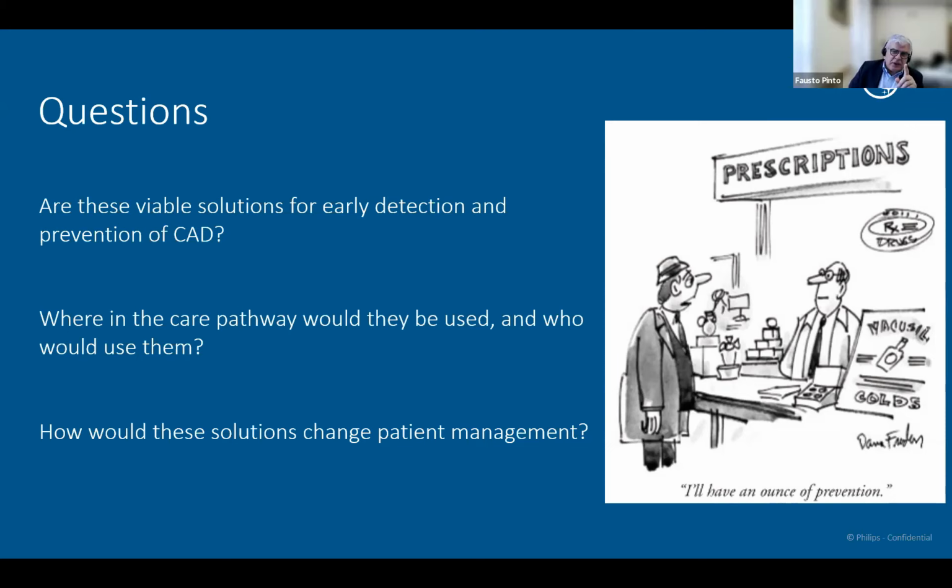No, one additional argument in favor of imaging is that you have an immediate result. With the blood sample biomarker, of course, important, but you don't have that readiness, immediate response. If you're gonna scan somebody, the result is immediate, and that may play a role here. But I agree with the comment of Tom that you will need, and particularly now that we still have a lot of open questions, I think you will need all these different elements. But I would say that imaging, because of the readiness of the result, the immediate result you have, you can take it to the bedside outpatient clinic.